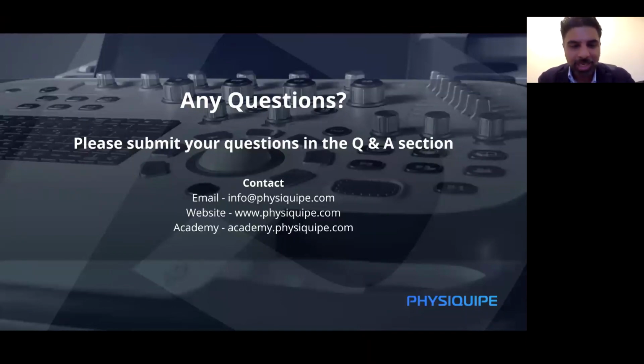Like, in my own clinic, I will see other patients from other colleagues who say, can you please scan this patient? Tell me what you think. I thought it was rheumatoid arthritis, but it's not behaving like rheumatoid arthritis. Could it be something else? And then you scan and say, well, actually, yes, you're right. It is rheumatoid, but the treatment that you've got this patient on is probably not enough. But because it was all subclinical disease, it's not really presenting.